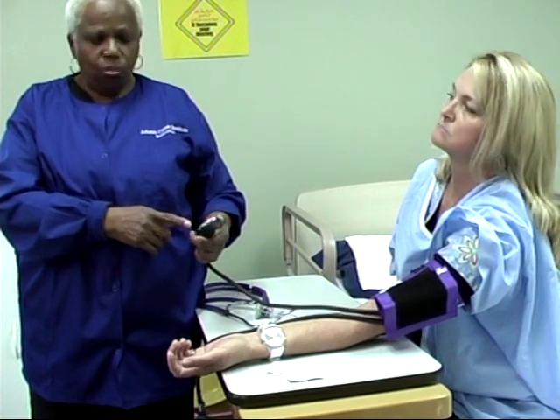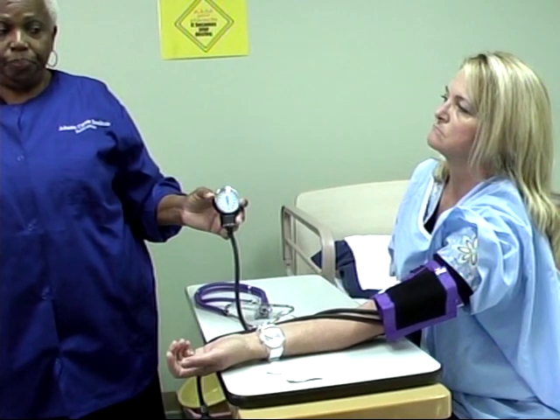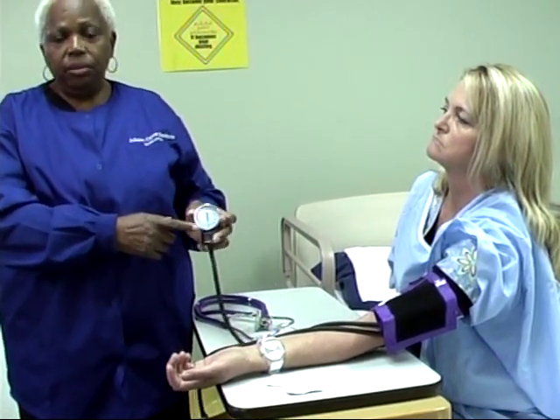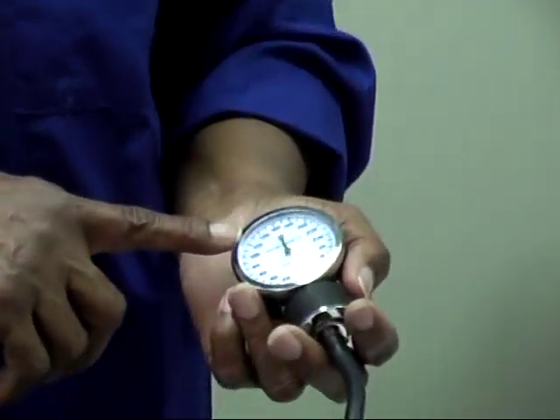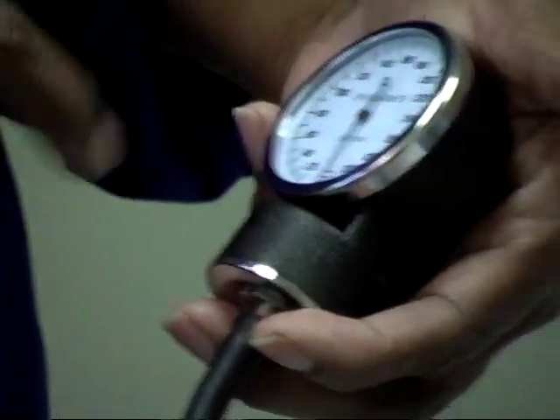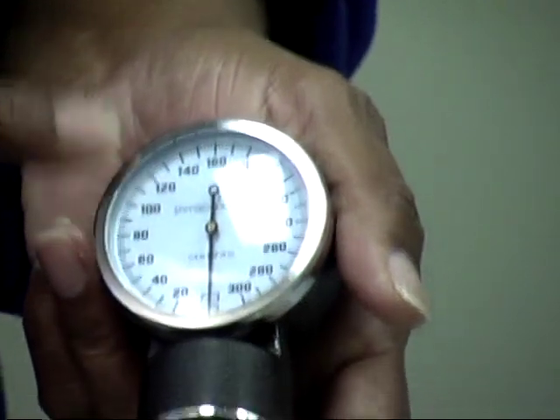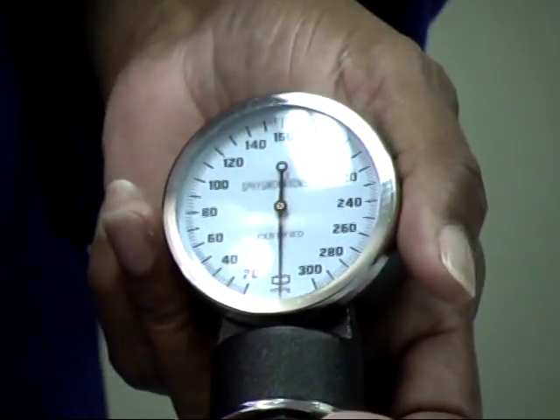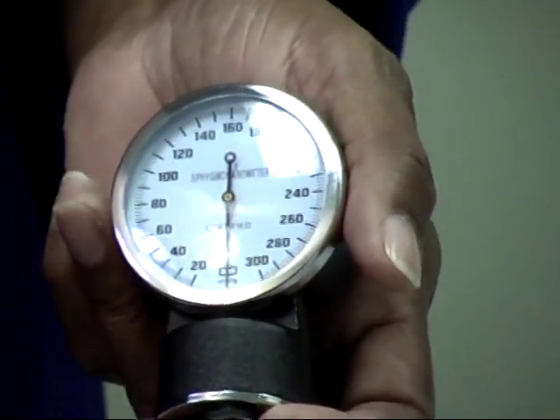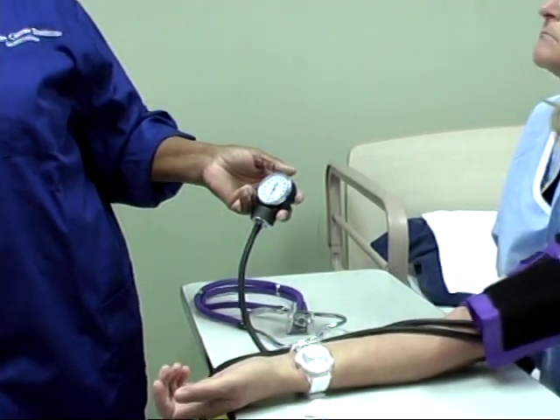Each one of these little short lines would be two. The long line marks the odd numbers. The even numbers you will see written on there, but the odd numbers are outlined by a long line, and the short line between them represents two. So there will never be 17 or 15 — it will be 16, 18, or 20.